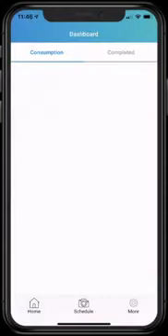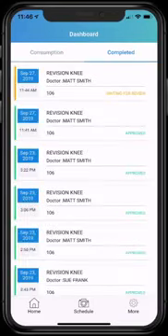Now the case has moved from the consumption tab to the completed tab, so we'll tap on the completed tab. We'll see our case is waiting for a review, so we'll tap on it.